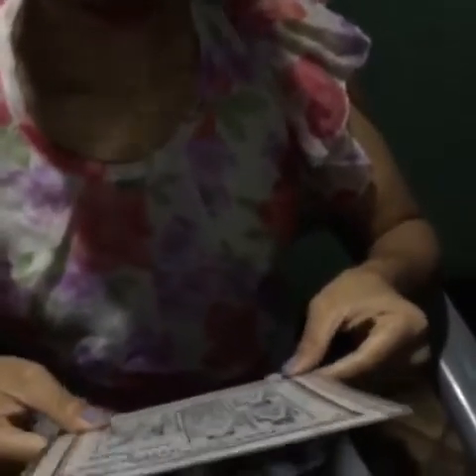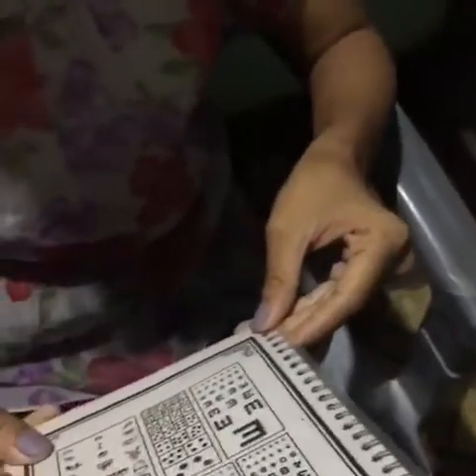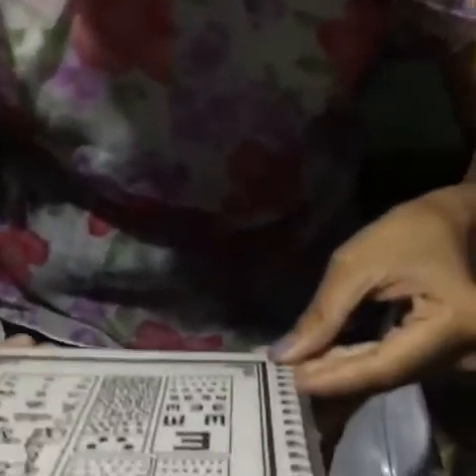And we will hold the near vision chart at a distance of 40 centimeter from her eyes, okay, a comfortable reading distance, which is 40 centimeter we will consider. So we will ask the patient to look at the N6 letter. For her, this is her best, her visual acuity is N6, she is emmetropic, okay.